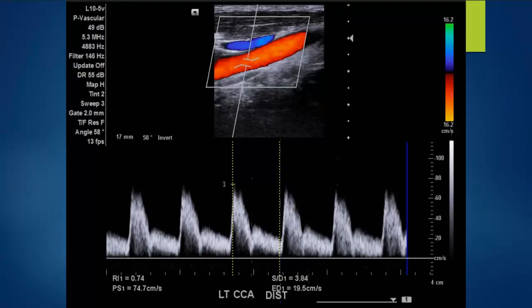So here we have a beautiful, beautiful Doppler example. Look at our image first. We have a carotid artery being sampled. We see that that vessel is traveling at an angle across the screen, right? It's not traveling perfectly straight across. We see that our gate is matching that angulation. Let me change my color here because I'm using red on red. Our gate is matching that angulation of the vessel. So that's placed properly. And then we're getting this beautiful waveform in our spectral analysis.